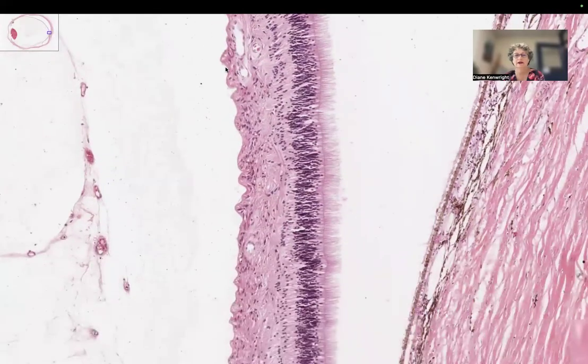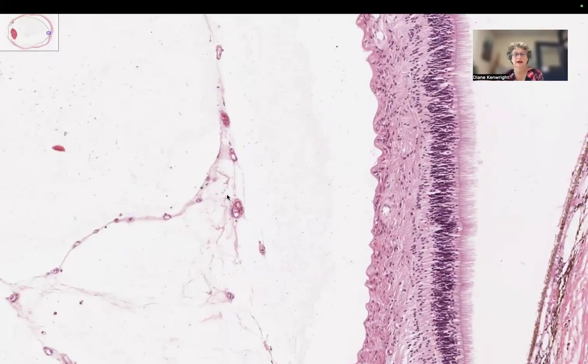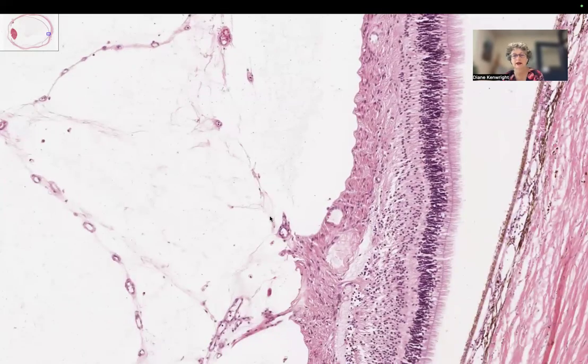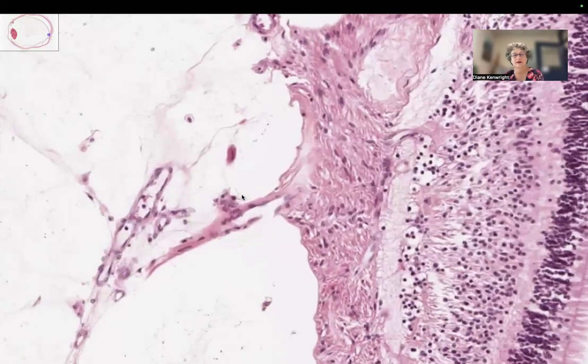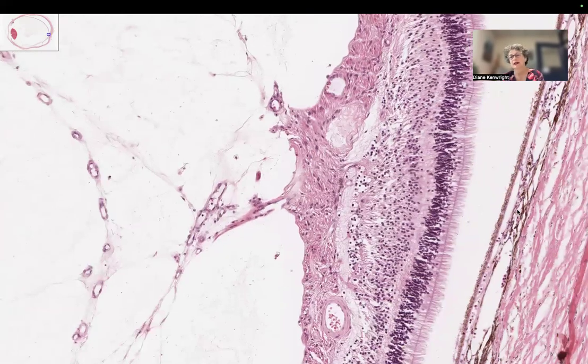Okay, so here we are with this lovely wrinkled retina. And then here in the vitreous, we're starting to get this fibrovascular proliferation. So we've got little vessels forming a chain here in the anterior part of the vitreous. And here we can see the launching point, which will be around the optic disc. So we've got massive neovascularization in the posterior eye, as well as the anterior eye.